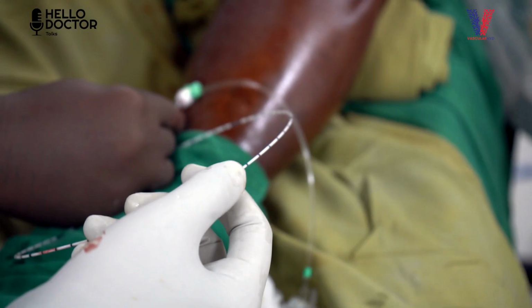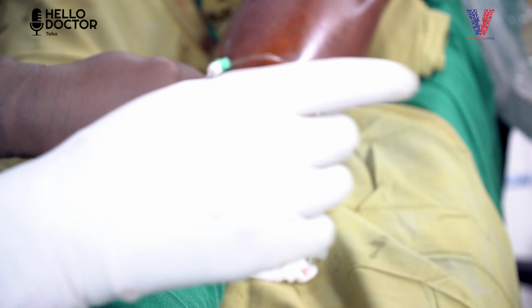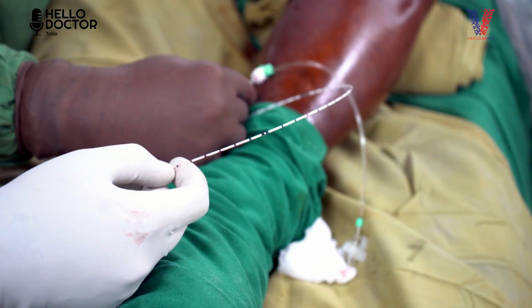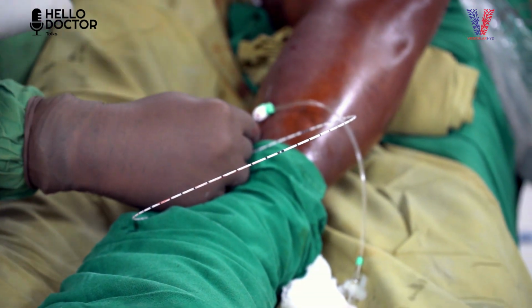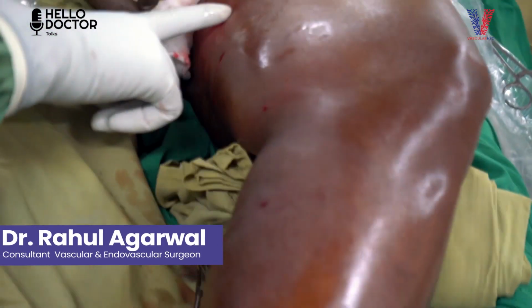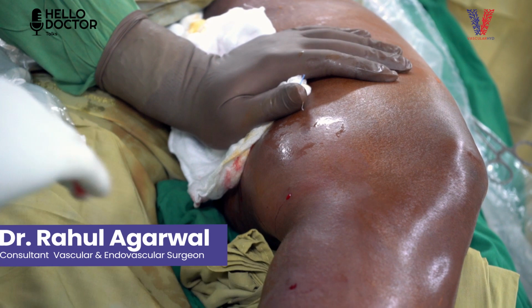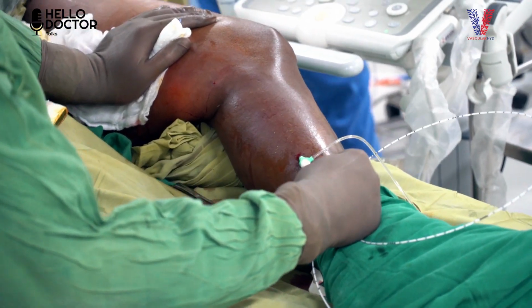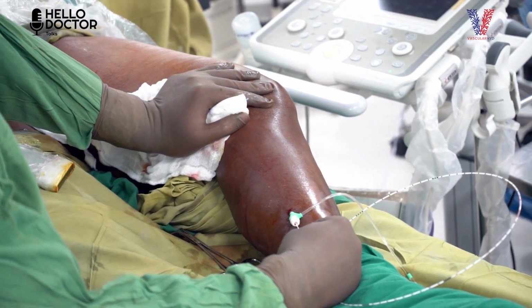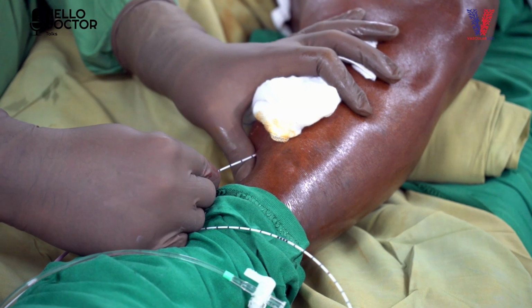So these are per centimeter markers. For every beep we pull out 1 centimeter. It can be continuous or interrupted; that's the surgeon's choice. Also you can see here the glow, that is the tip of the fiber. We put a mild compression there. Tighten here.